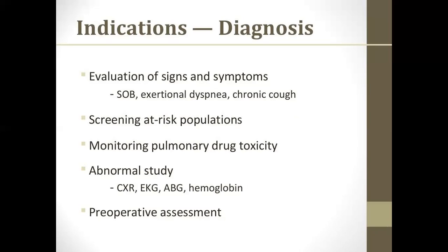The indications: diagnosis, evaluation of signs and symptoms include SOB, that is, shortness of breath, exertional dyspnea.